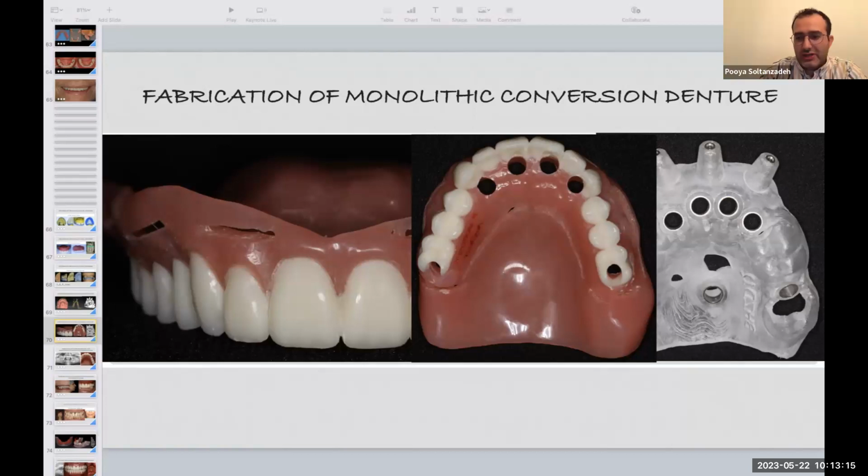So the surgical guide will be fabricated. They send you the denture with the pre-cuts. The only thing is, you never know during surgery about the implant stability, because you need to load the dentures if the implant stability is great. But if not, then you may end up not attaching these dentures to the implants. That's the only drawback of having those pre-cuts.